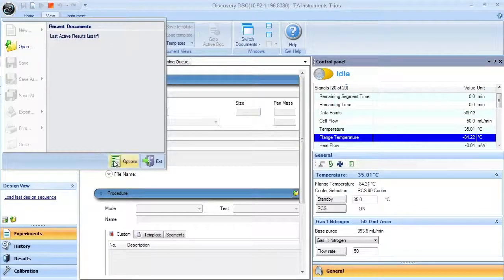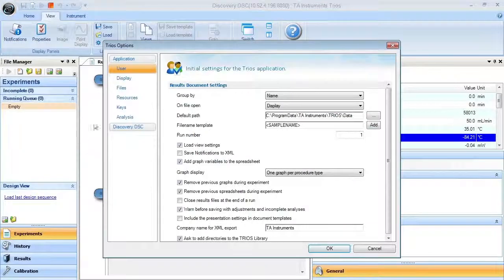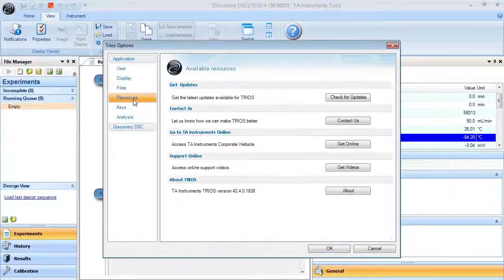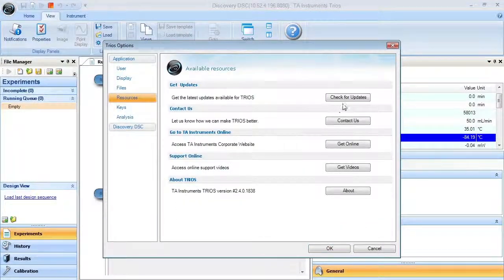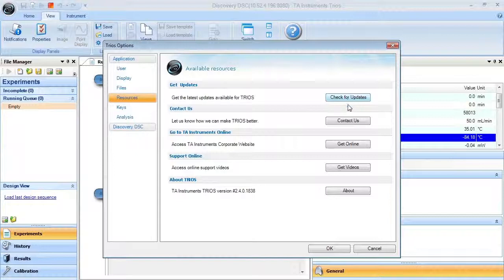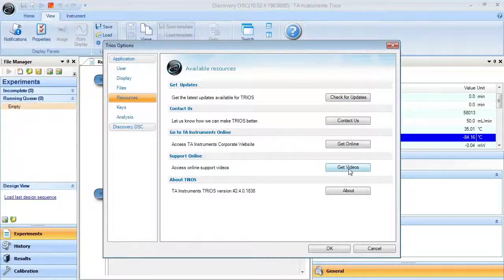From the options, you will find the resources needed to check for TRIOS updates, access online videos, and contact us if you have any questions regarding TRIOS and the Discovery DSC.